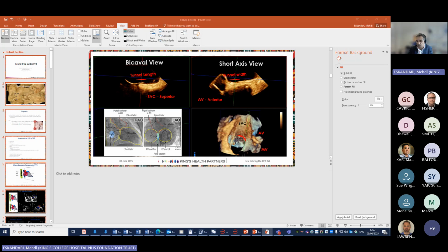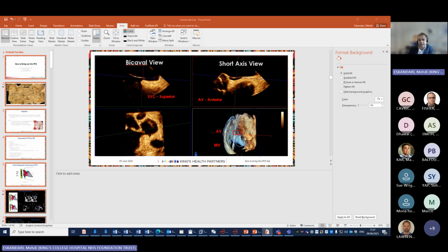And if I show this to you from the left side, you can see that the exit is at the top part here. That's the fossa. And therefore, this is the width as I'm moving. We are interested in the right atrial side of that width because the device will sit on this side, and if you occlude that part, there won't be any shunt. Therefore, the width itself is an element. The tunnel itself is an element. And the separation is more about the risk of a stroke rather than procedural implication. And the question will come, which one to use to do sizing, if there is such a thing for the PFO, and we'll talk about that a bit.